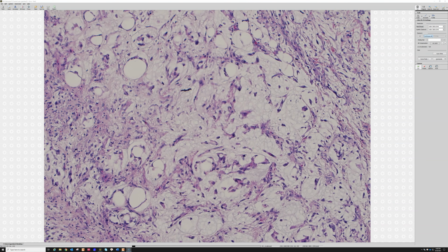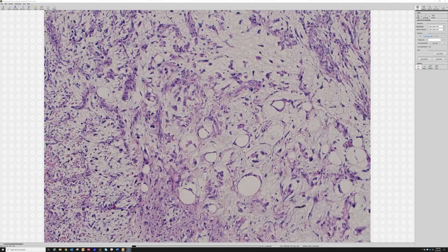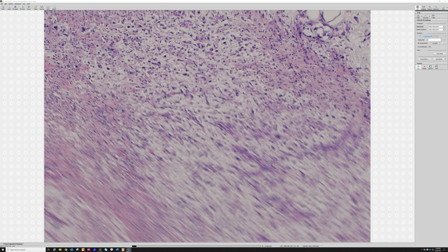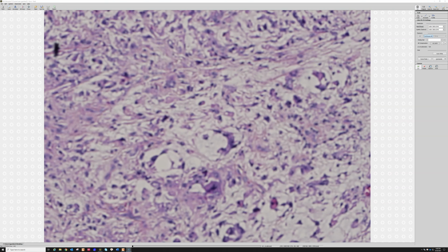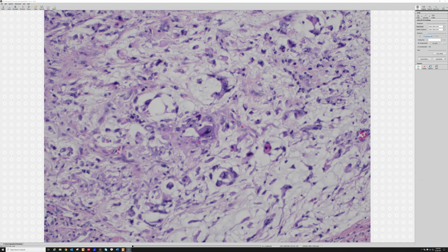And if you have trouble remembering how to tell apart Myxofibrosarcoma from low-grade fibromyxoid sarcoma, because the names are maddeningly similar in the sound, I do have a video that's like 5 minutes long and will help make it really clear to you that these are very easy to tell apart. They are not lookalikes, they are name-alikes. They sound similar, but almost never do they look like each other, with very rare exception. Okay. And I do have a full-length video about both low-grade fibromyxoid sarcoma and this entity we're looking at here, Myxofibrosarcoma, and I'll put those links below as well.